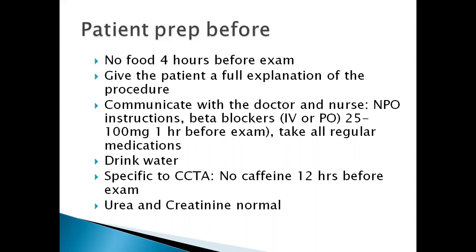But don't just end on giving a full explanation to the patient. You have to also now communicate with the doctor and the nurse. For example, if a patient is in the ward, which is most of the times, though we do have walk-in patients as well, you may want to tell the nurse and emphasize that the patient should not eat anything 4 to 6 hours before the examination. You also tell the nurse that the patient shouldn't take any caffeinated foods 12 hours before the examination.